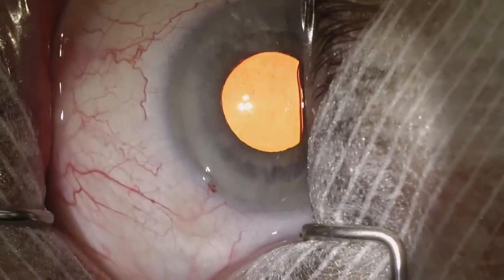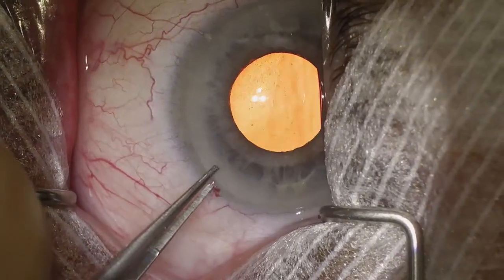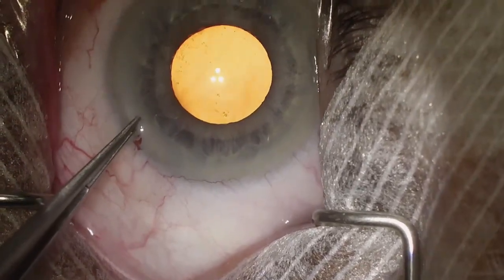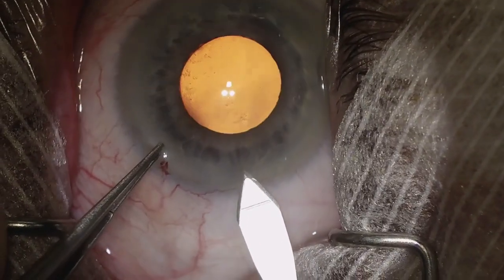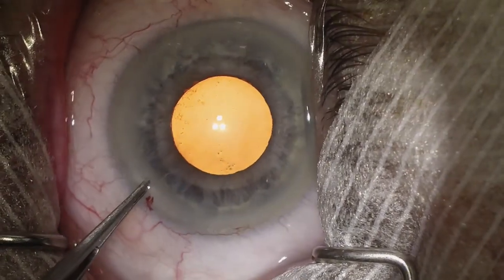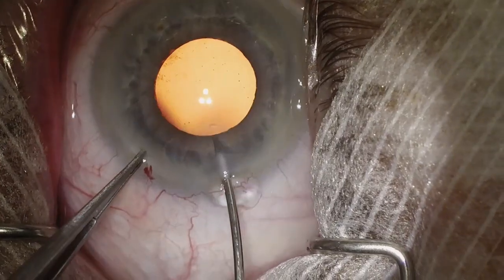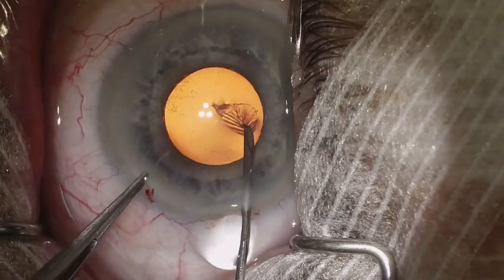This helps to coat the endothelium and can provide some visco-dilation. I want to make sure we're nice and well centered with our scope and we're comfortable. I use 0.12 forceps to stabilize the globe, grabbing the paracentesis, and then I use my keratome blade to make my main incision. At this point you can consider using any pupillary expansive device whether it's a Malyugin ring or something else, but in patients with a pupil this size I'll usually just proceed with surgery.